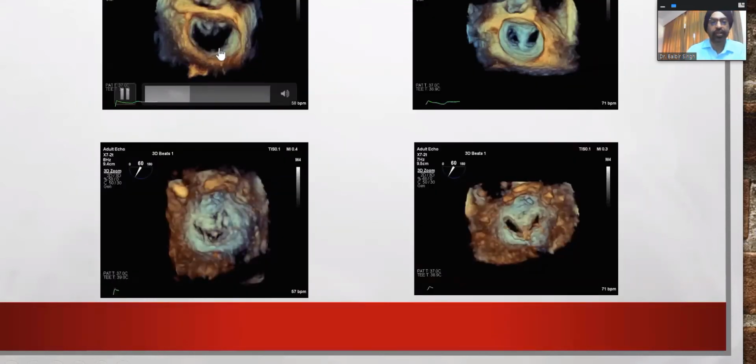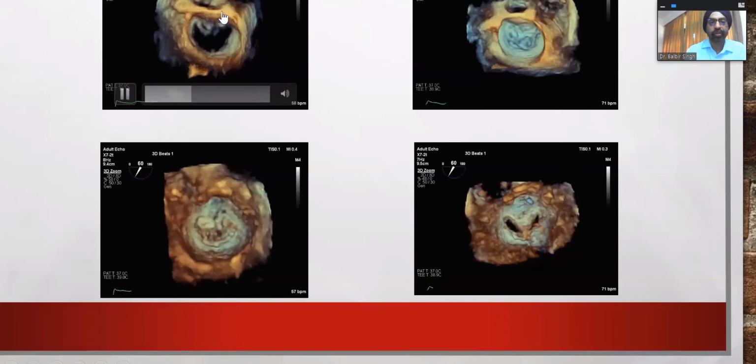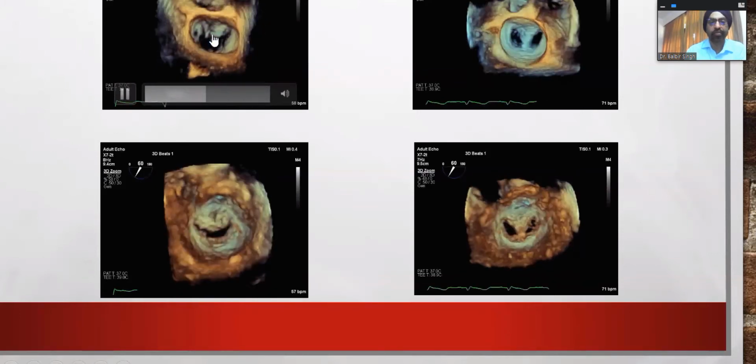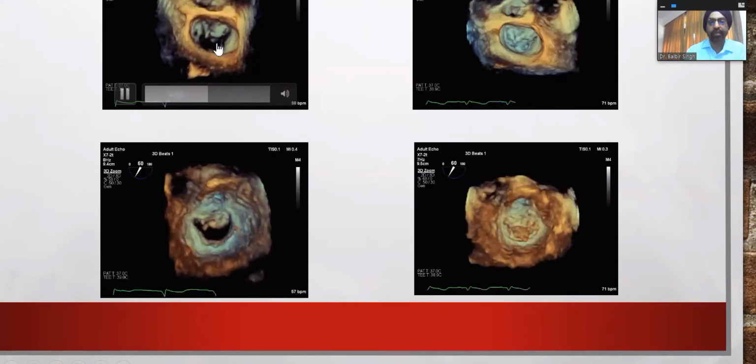This is the 3D en face view. So you see the aorta in front. This is the mitral valve. These are the two leaflets. You see the anterior mitral leaflet is flail. You see the gap when it closes.